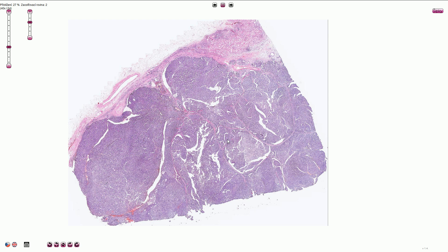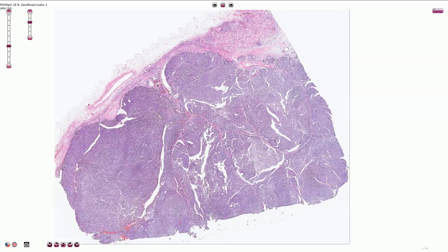Papillary carcinoma usually shows predominantly papillary architecture and it frequently has a well-formed fibrous capsule. In this part of the picture we can see residual renal parenchyma. Here we have perirenal adipose tissue and this large papillary mass — this is papillary renal cell carcinoma.